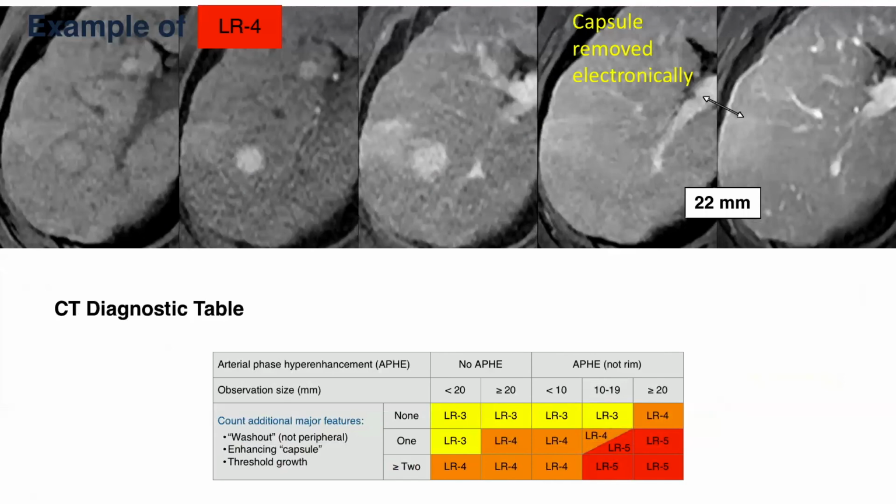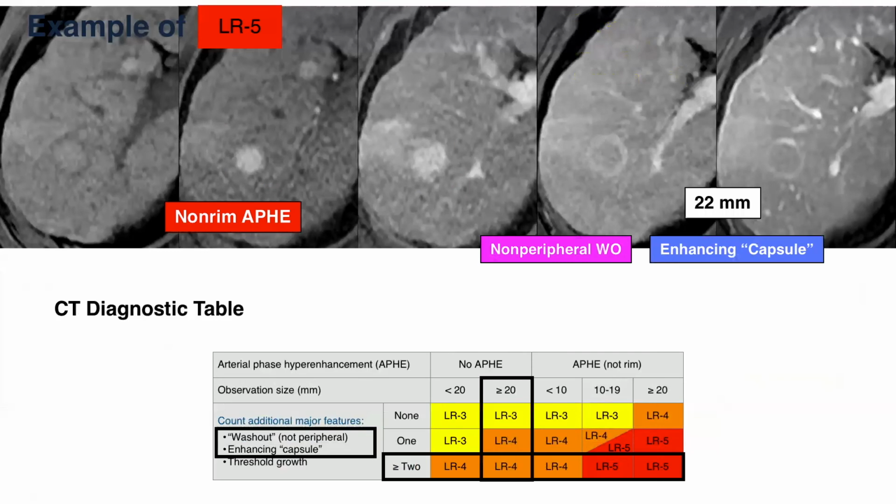Okay, I just want to show you one thing here though. Let me ignore my animations here. What I want to point out is the following: a lot of radiologists will say that a lesion like this has washout, because it hyperenhances, and then on these more delayed images it sort of looks like it might be darker than the liver. It certainly is darker here than it is here, right? So radiologists will often say that this has washout, but this is not washout. This is the optical illusion or the visual perception of washout caused by the fact that there's a capsule.